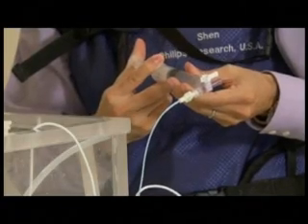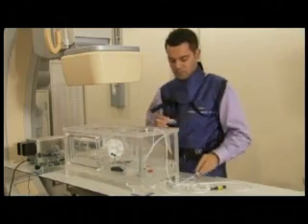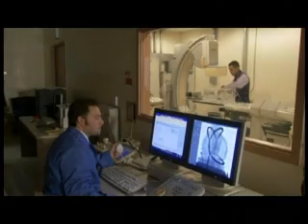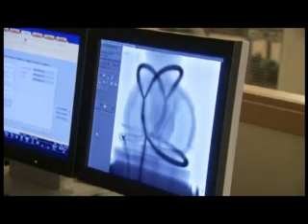These catheters can also be used to inject a contrast agent, as shown. The contrast agent allows us to selectively visualize the vascular space that has been filled, while leaving the rest of the heart with its normal image appearance. This ability to selectively opacify the coronary vessels allows us to test new X-ray technologies like rotational imaging.